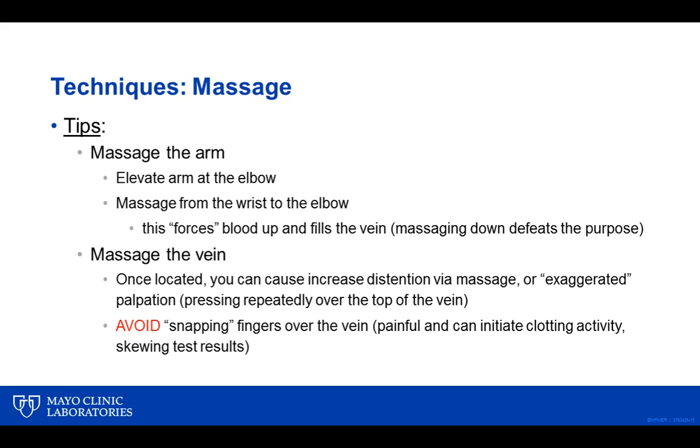For starters, it's often painful depending on who's doing the snapping. And it can also start to initiate some clotting activity. As I said, the reason snapping works is it aggravates that smooth muscle, so that makes the needle insertion more painful. That initiating of the clotting activity is caused by banging on that vessel with the finger, and that can skew test results, especially coag tests.